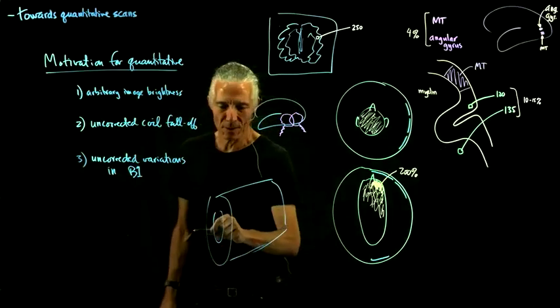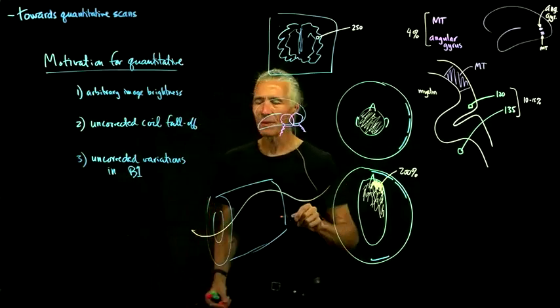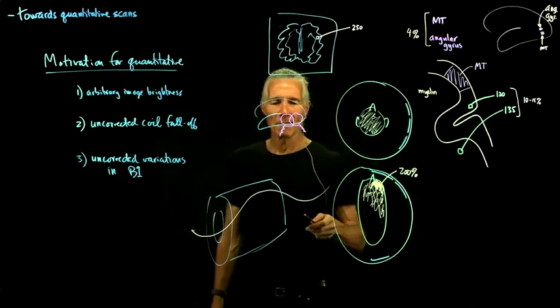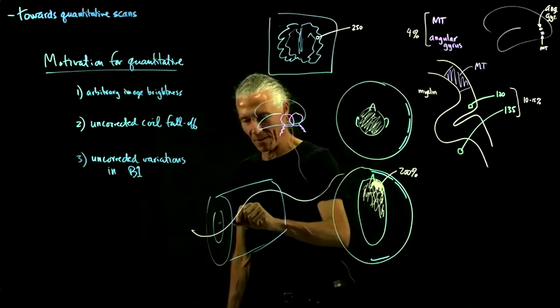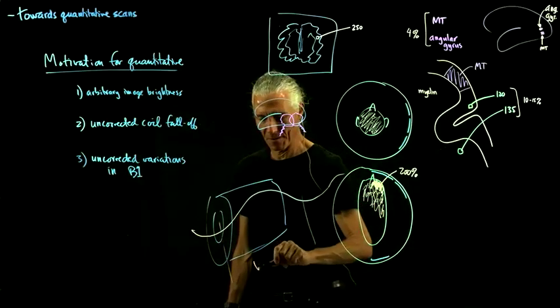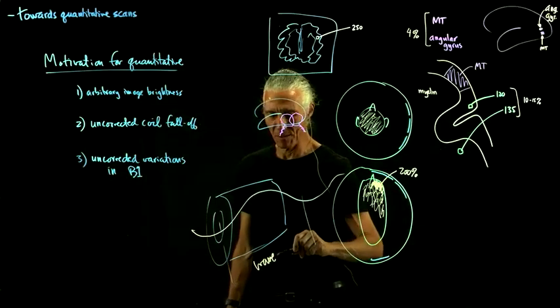The wavelength is going to be quite big, like an FM radio station. So this is the wavelength here of those RF radio frequency waves.